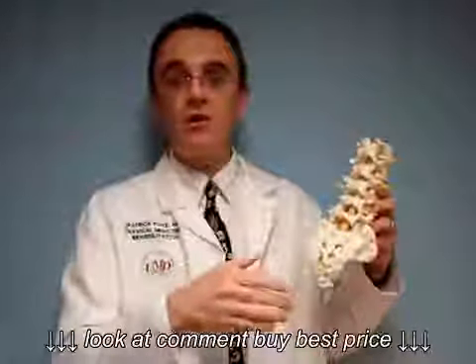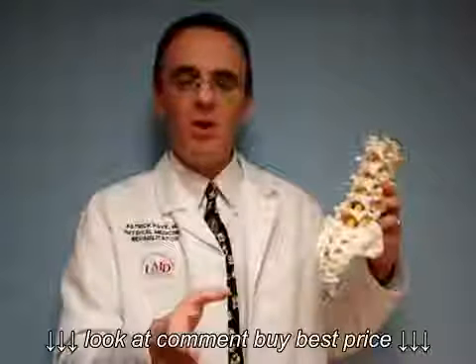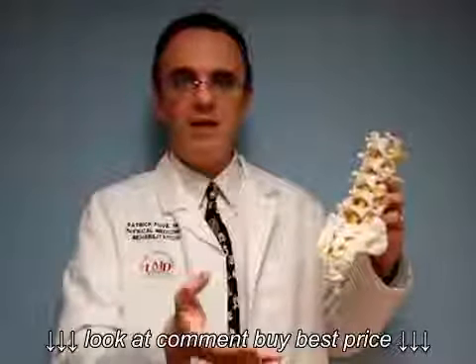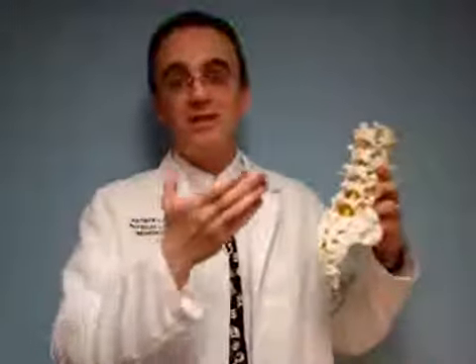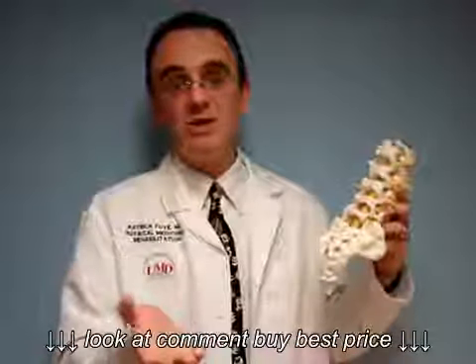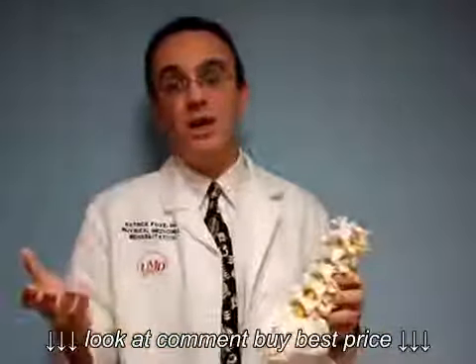even though perhaps you and your doctor thought that the reason the MRI was being done was because of the coccyx, and of course it would be included, and of course the radiologist would have commented on it. You may find that not only is it not mentioned in the radiology report, but it's not in any of the images either. And it's really unfortunate, but it happens all the time.